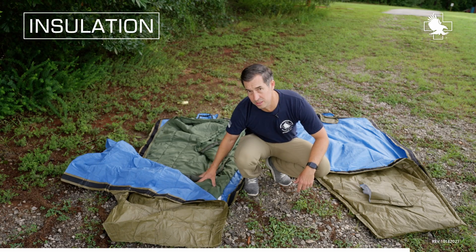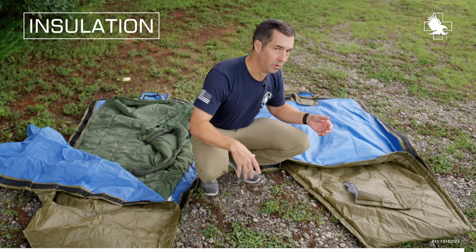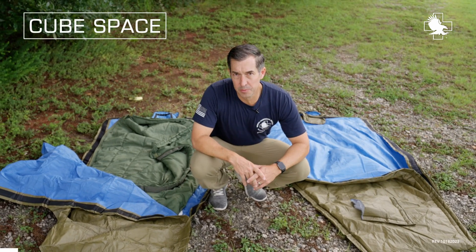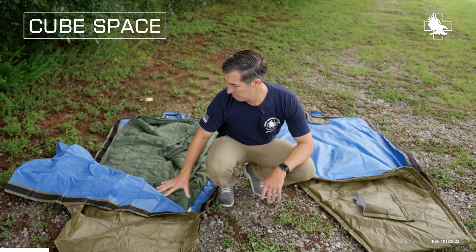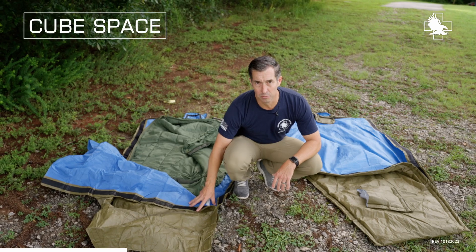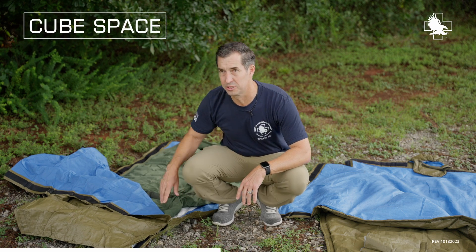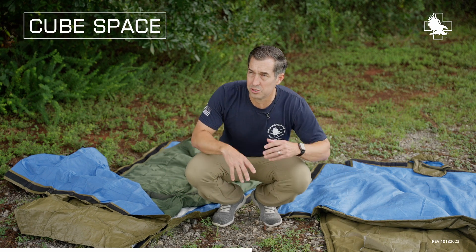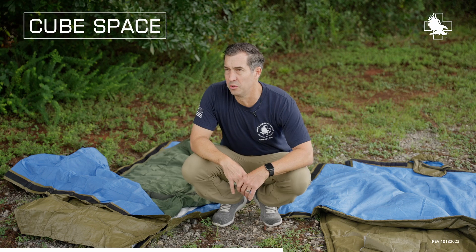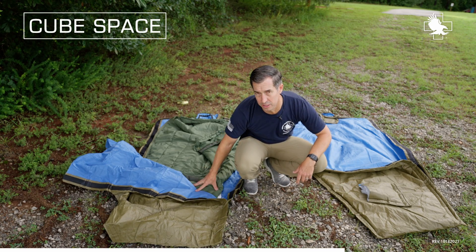The HPMK with the sleeping bag is the equivalent of the HPMKi, except it's all in one package. When we talk about cube space, if you use the HPMK plus the army green sleeping bag, you're going to be packing more cubes than if you just take the HPMKi. An added advantage is when the casualty goes, you don't lose a sleeping bag — all you lose is the HPMKi, and you use a new one. So the HPMKi will pack up tighter than the HPMK plus the sleeping bag.